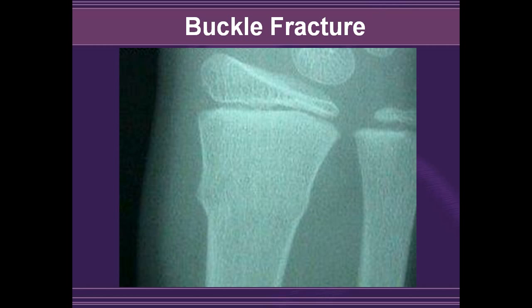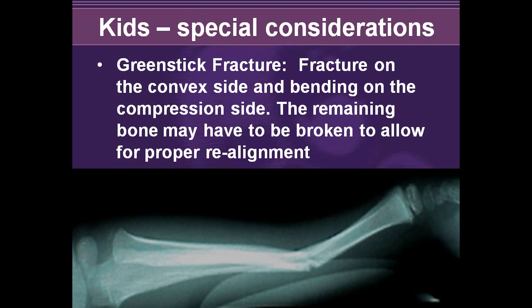This is an example of a torus fracture, where there has been stress and the bone has buckled. There is no actual lucent line seen across the bone itself. A greenstick fracture is a fracture on the convex side with bending on the compression side. The remaining bone may have to be broken to allow proper realignment. In this example, you can see at the apex of the area in question there is a fracture, but on the concave side there is no fracture seen — simply bending.